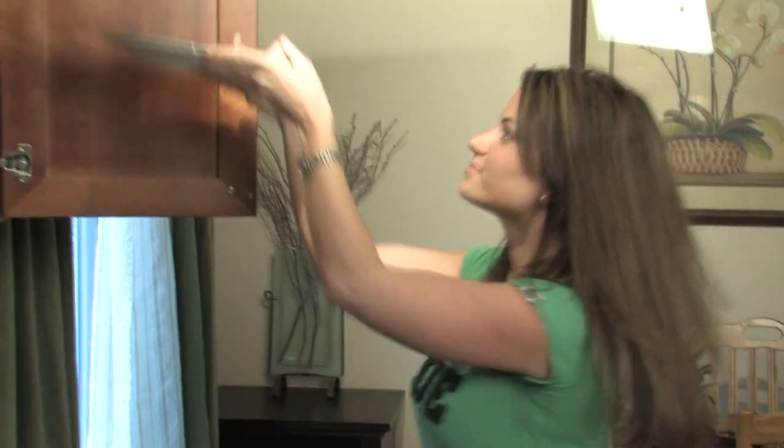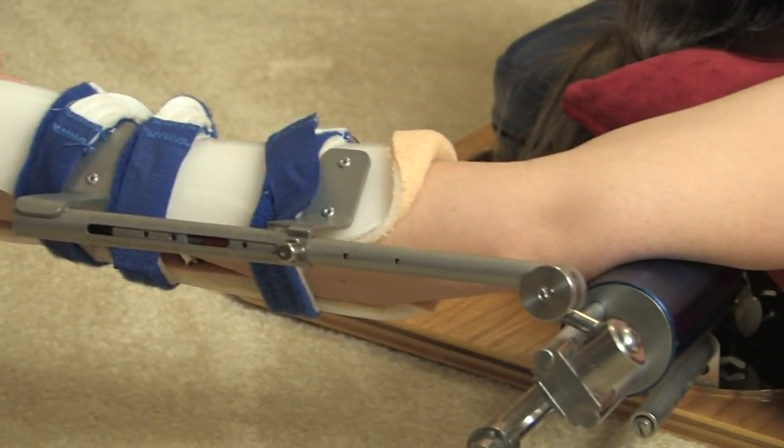It was hard to do activities like working out, putting plates up in a high cabinet, putting on my makeup before work. At one point my range of motion was so limited that somebody suggested that I use a Dynasplint for my frozen shoulder.